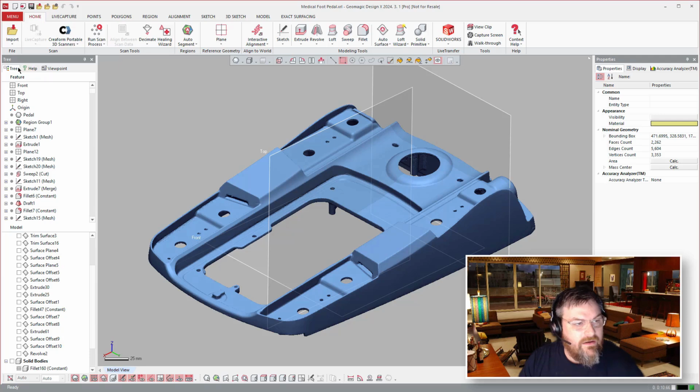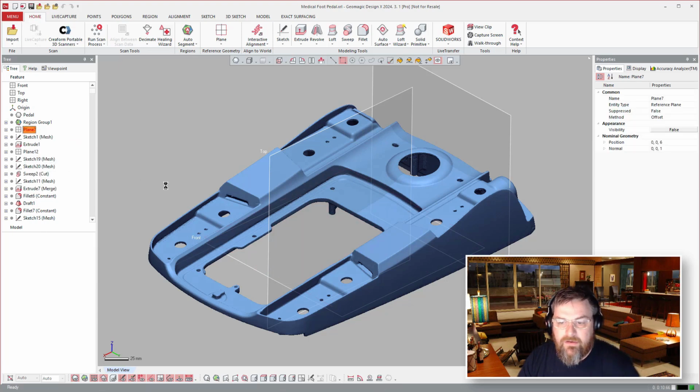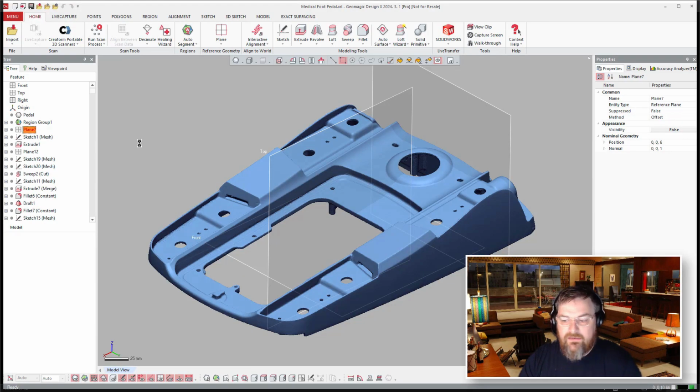You'll see over here on the left-hand side, I have my feature tree. The first thing in the feature tree is the scan, a polygon object, and then a region group. I'll roll down just after that, and we will do a rollback. Those of you that have used history-based parametric CAD models, this is very similar technology, where you have this history base and the features build upon each other.